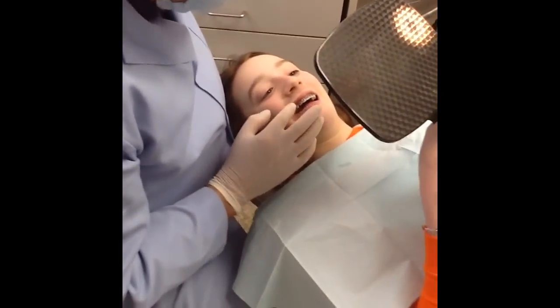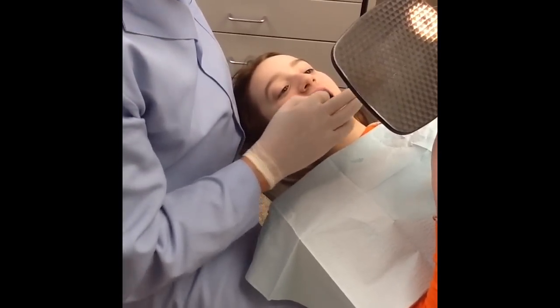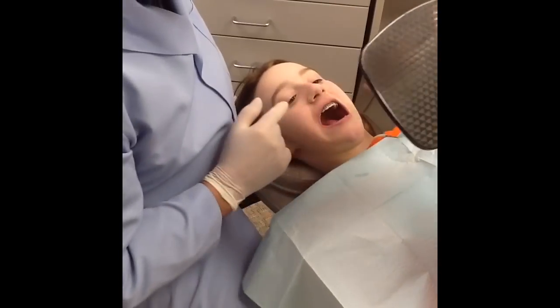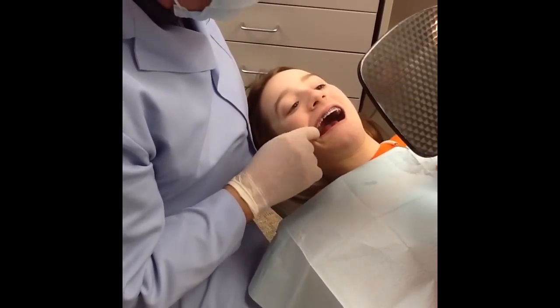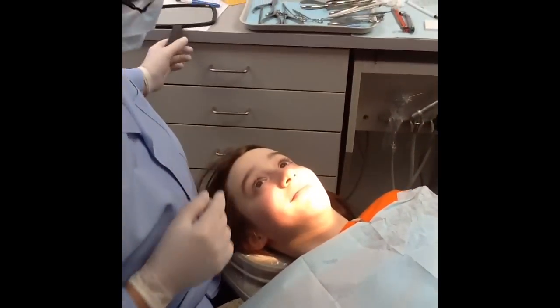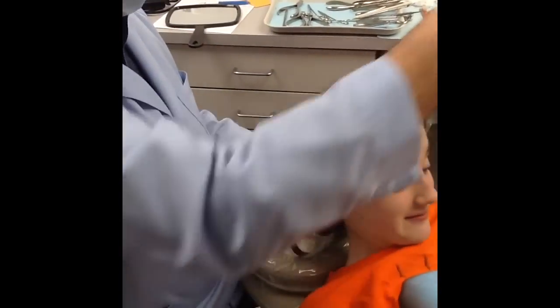So these little bumps are part of the braces, so it's just something that your cheeks and your tongue will get used to. Is that easier than it's going to be? Yeah. Good, good, good.